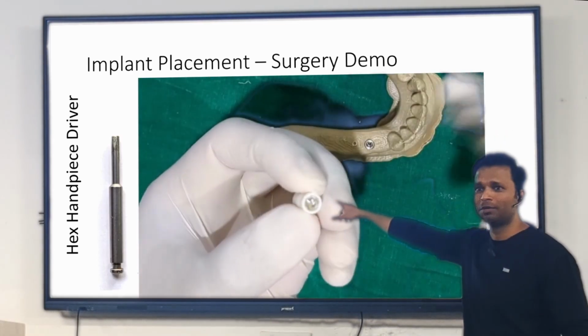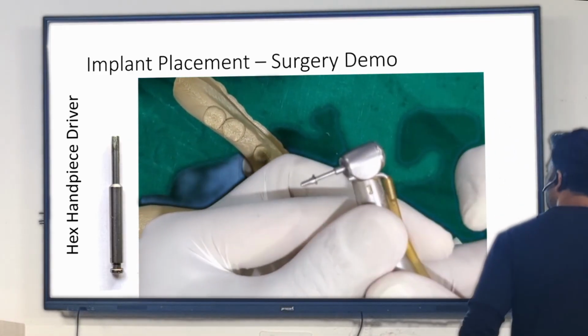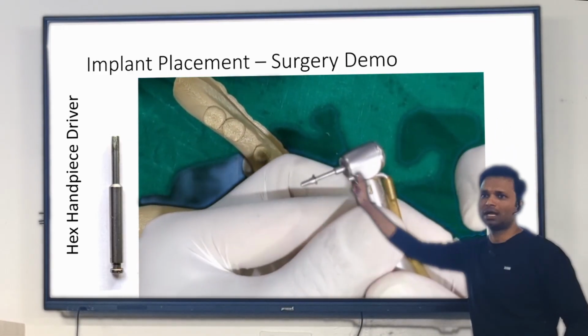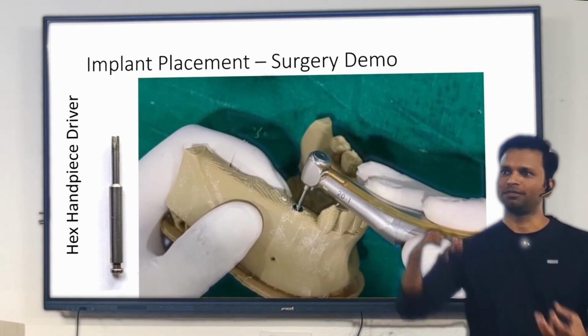So I told you about this cap. Remember this cap. Inside this cap we have the cover screw of the implant. Okay. Can you see the cover screw is now attached to the hex driver? Now this is going to be inserted on top of the implant.